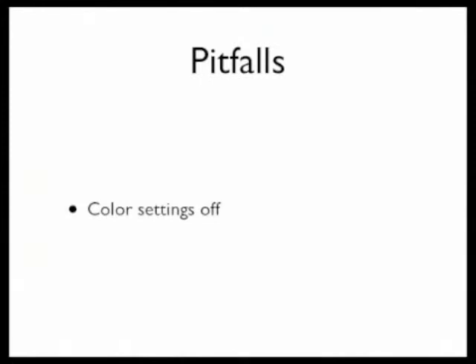That is the setting that doesn't give you any directional information, but who cares? I mean, you don't really care all that much about directional information in the testicle. You just want to see if there's flow or not. So use a power Doppler. Don't hesitate to go to that if you need to.